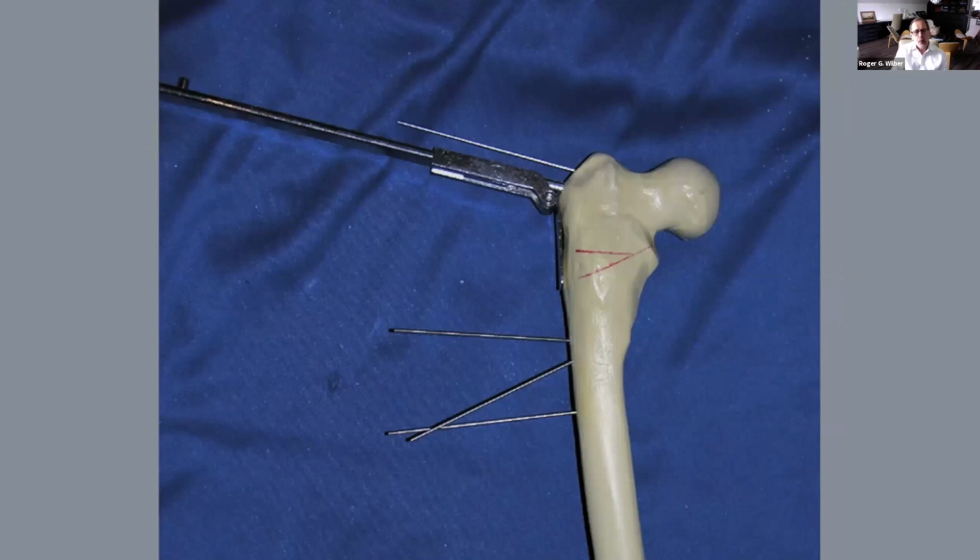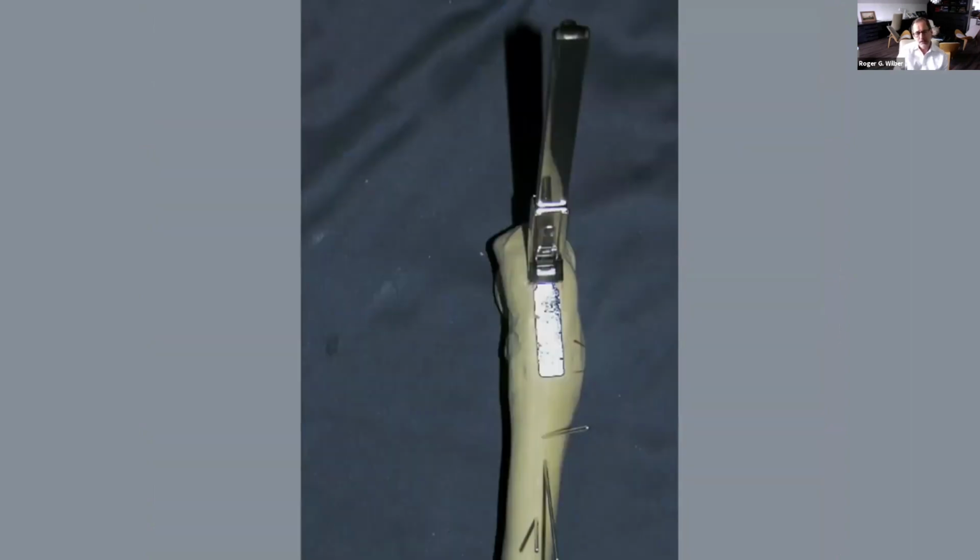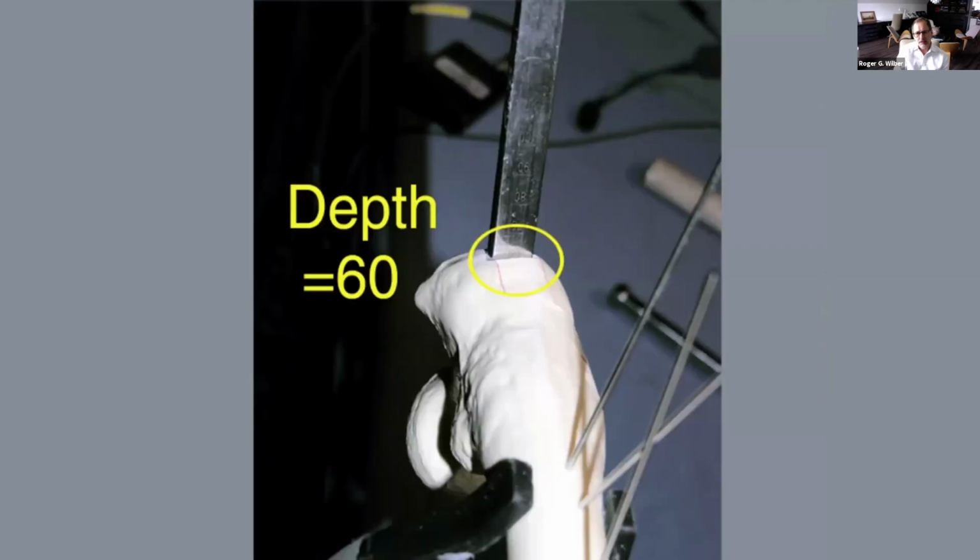This is very important. Make certain that you create a very good chisel path before making any cuts. If you make the cuts first and you're trying to create a chisel path, you're going to be extremely unhappy. So make the chisel path and make sure you back it out a little bit before you make any of the cuts. And there we have a little bit of flexion in it.